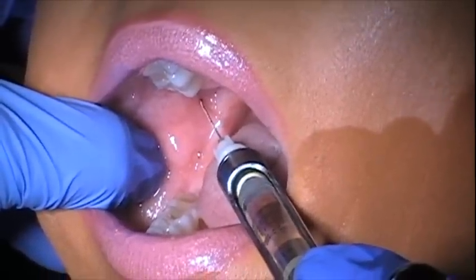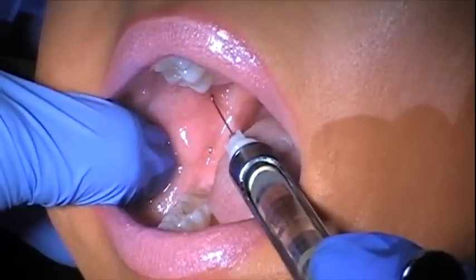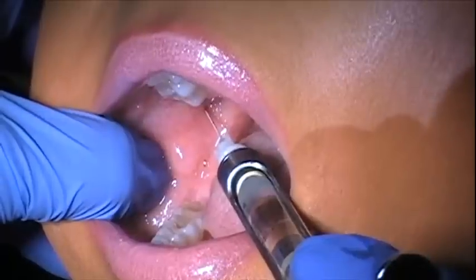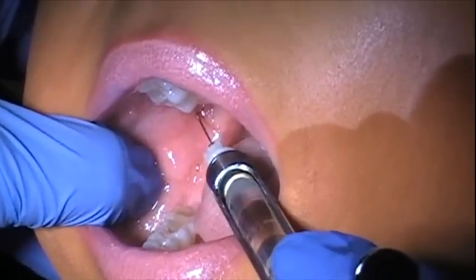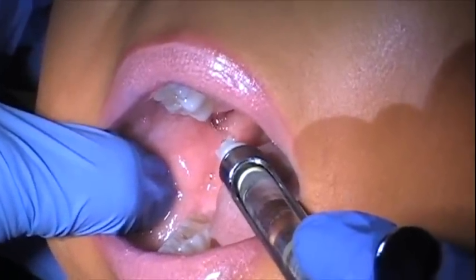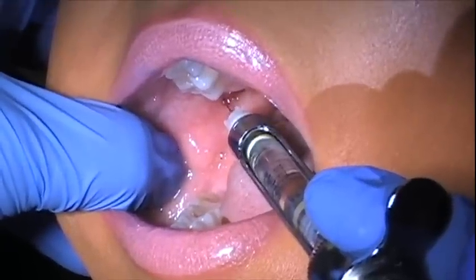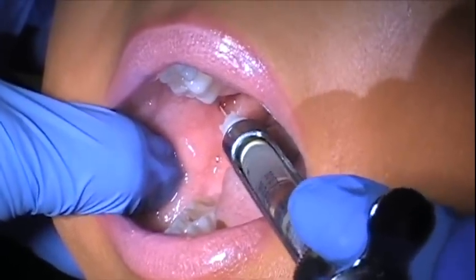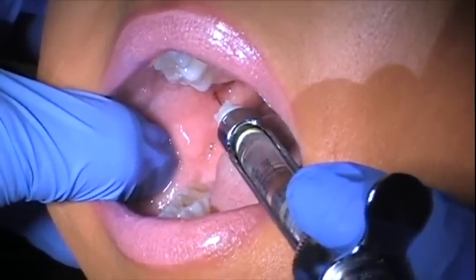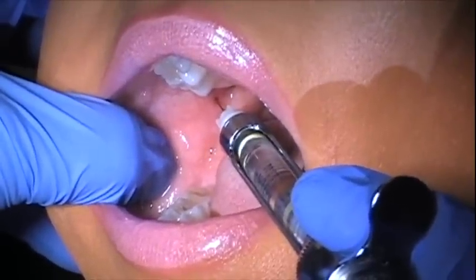Wait five seconds. The patient needs to stay open nice and wide, and then I'm going to slowly advance, aiming towards my finger in the notch. On this one it's pretty deep but I've contacted bone. I'm going to aspirate and then deposit the entire carpule.